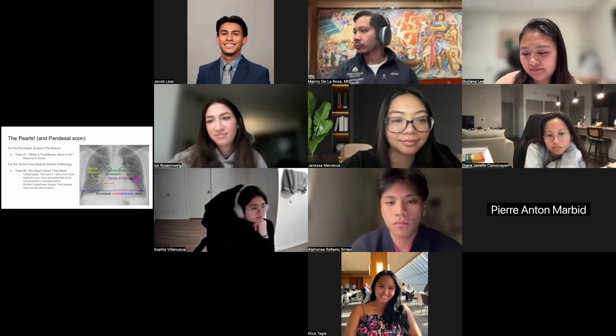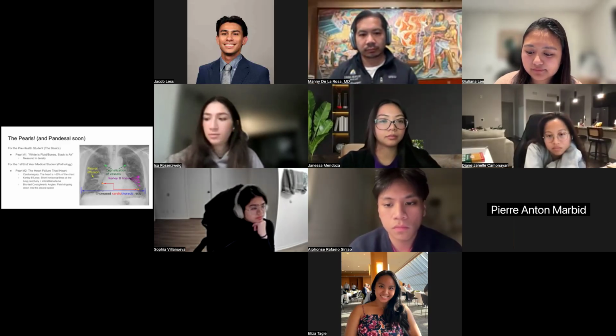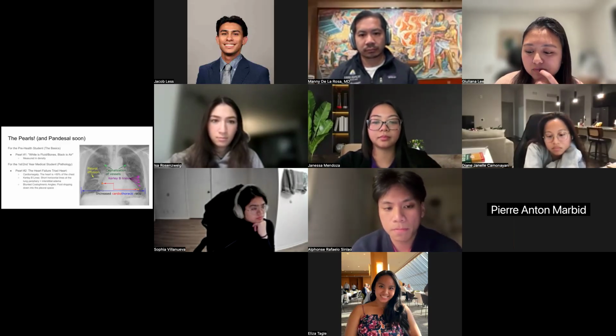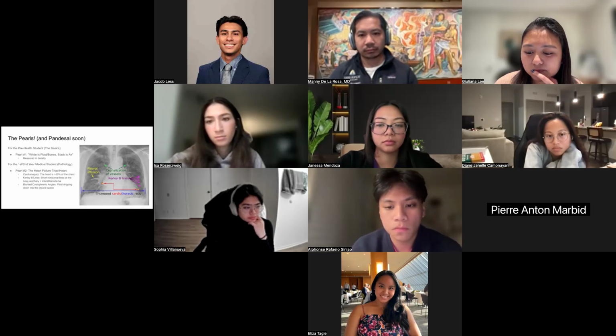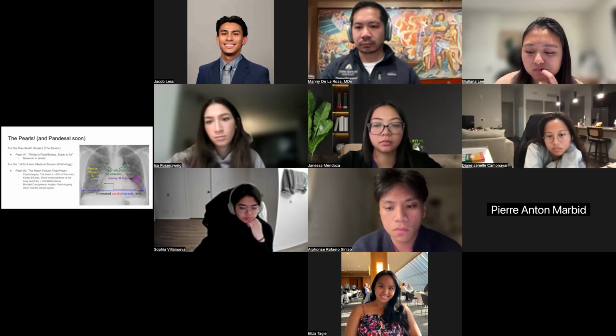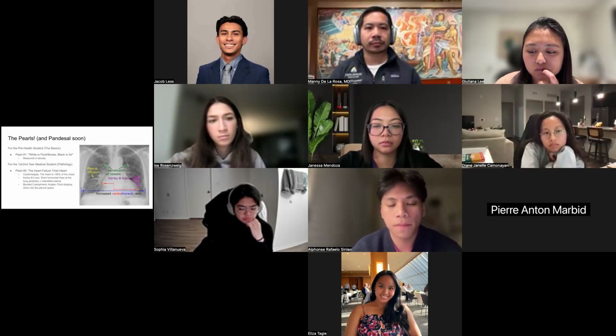Trying to break it down by training level, but of course, take what you remember and apply what you need for your different spaces. For pre-health students, as you're going through these slides, really just focus on the basics. What is white? Usually it is fluid and bones. Black is air. Try to picture that with your physiology and your anatomy. Try to think of where the different structures are when you're looking at bones, and why black spaces are black spaces, and know that x-rays are measured in density. There are different types of units, as we'll see, for different types of scans. So that's just something that you can think about.